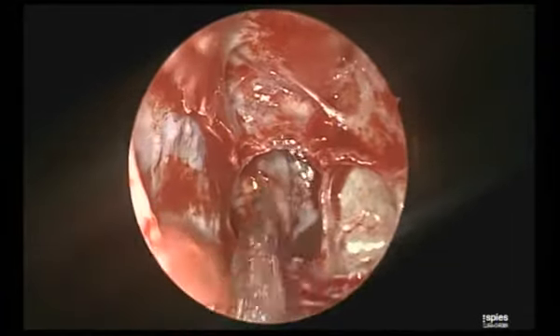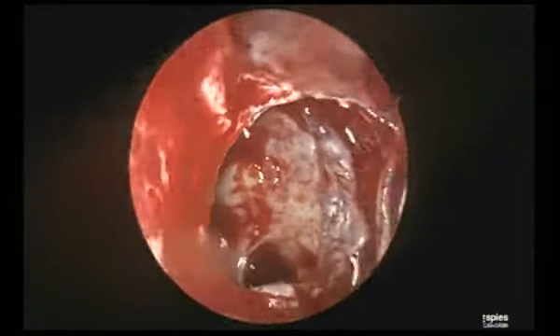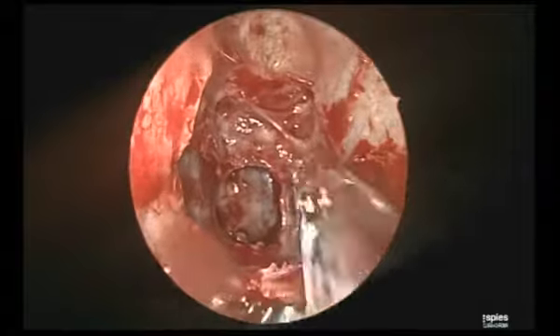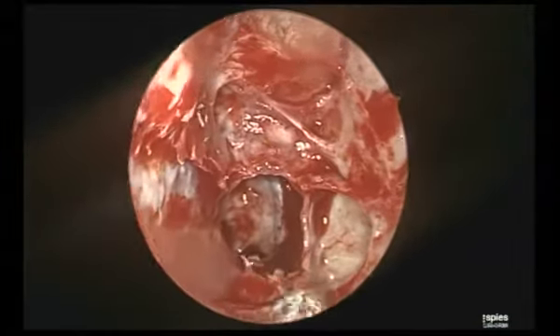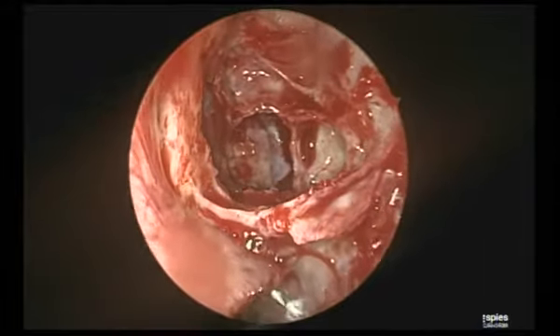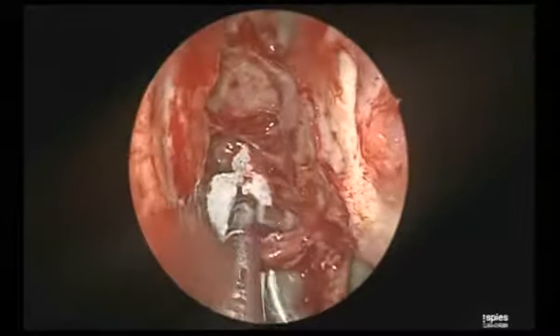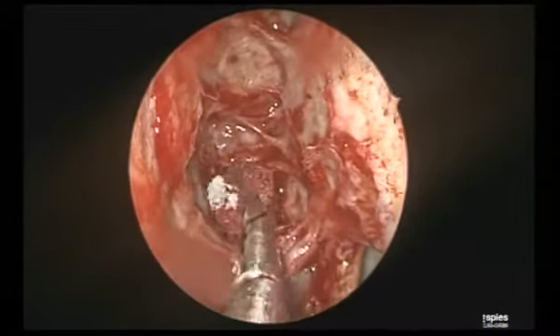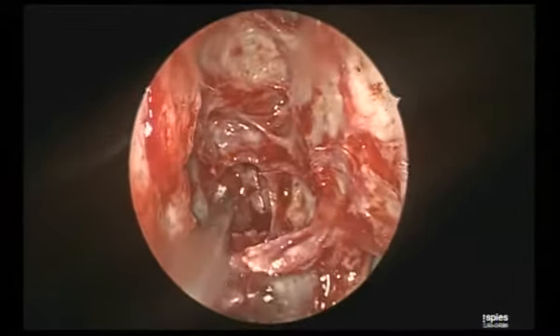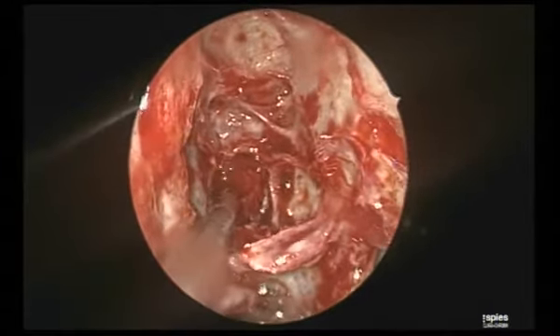Okay? So, surgical tips here for this widening. This simple mucosa that is coming, to debride it? No, never. The surgical tip is: stay at the ostium level. No instrumentation inside the sphenoid at all. This is an inflammatory, benign disease. You can't afford to give such a complication by doing anything blindly into the sphenoid.